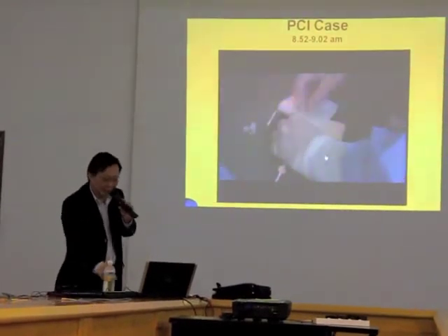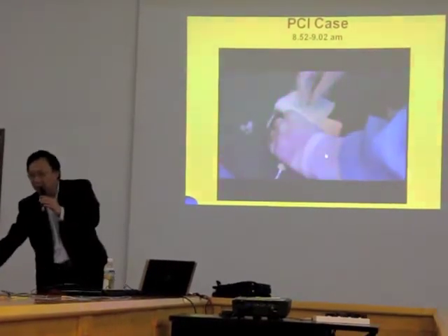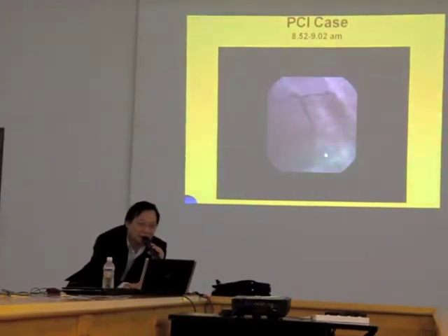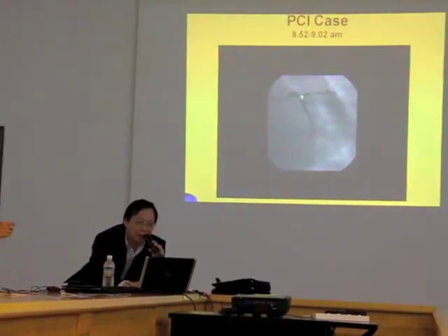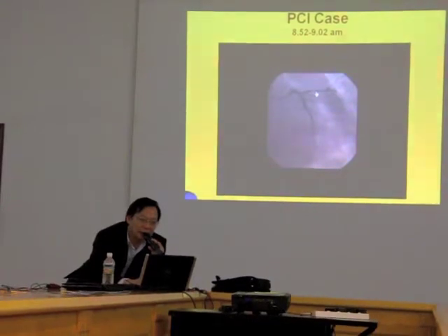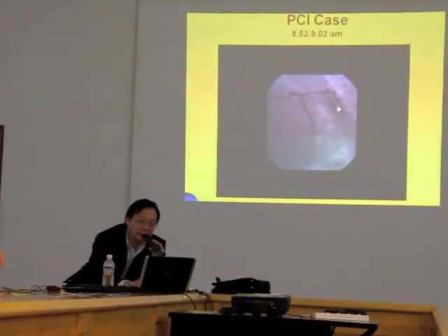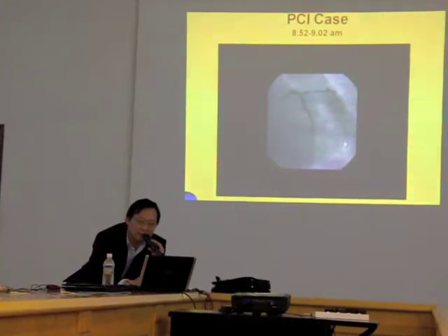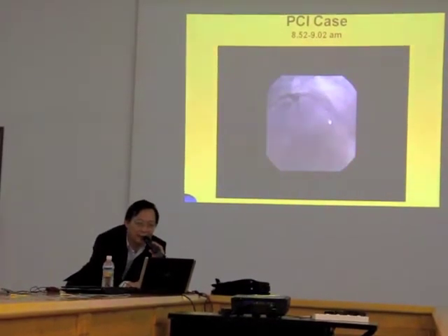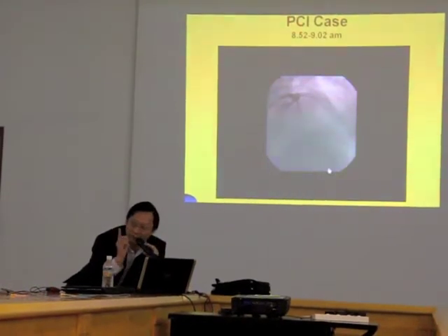This wire goes into the catheter and follows it into the artery. The wire has now crossed the lesion already — you can see a black line here. It has entered the lesion, and I advance this wire all the way down the artery.